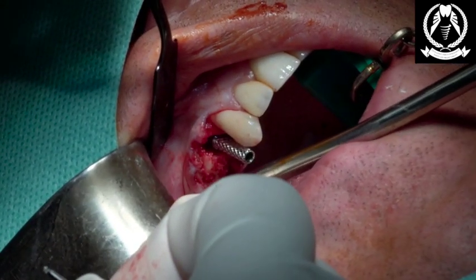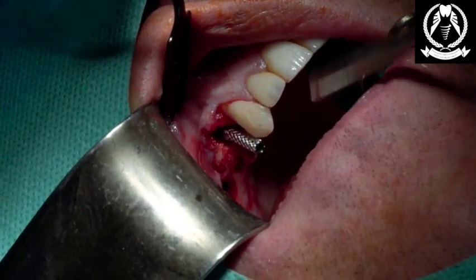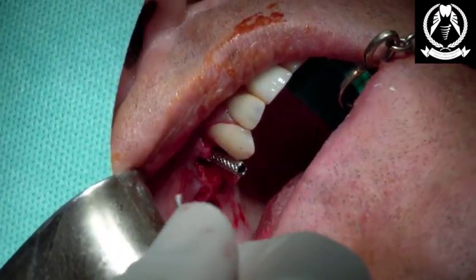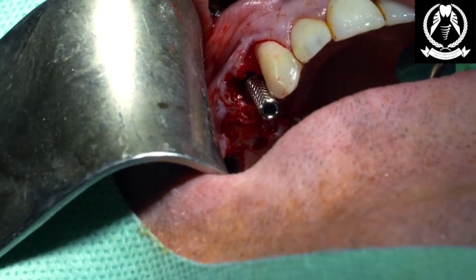And we can probably put a healing cap on the back. Can you get me a wide bore healing cap? And then I'll just do the grafting. Couple of stitches. Jobs are good. Perfect. And just going to put this on.